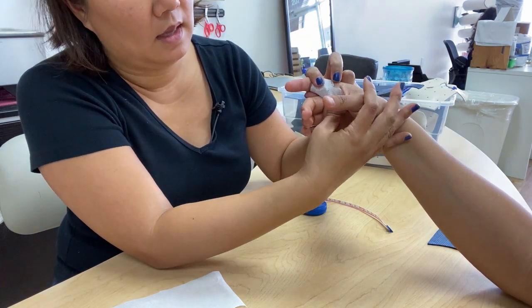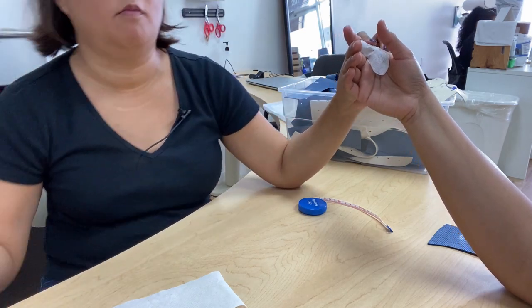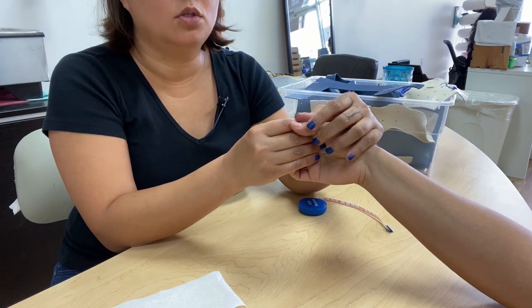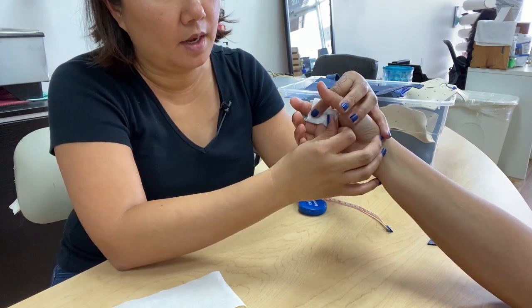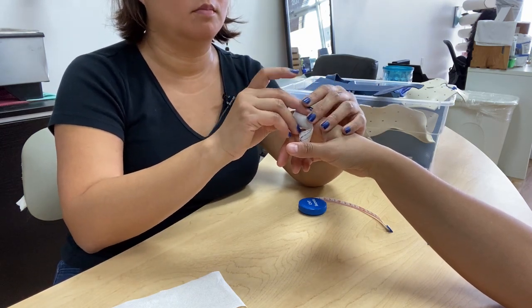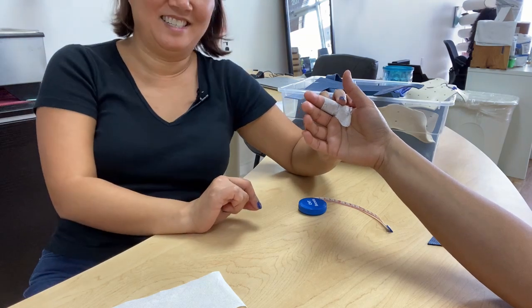I pull the thumb in and that way you have a little bit of a curvature. You can't have everything in one splint — it's got to be flat but it's got to be curved. You have to explain to your patient that it's going to be something that has to fit. If that's your dominant hand, it's okay that there's a little curvature because they ask 'but what if I go like this?' — well, stop giving people high fives with this hand. Pause your high fives for a little bit. Those are some tips when it comes to creating a trigger finger orthosis for an index finger.